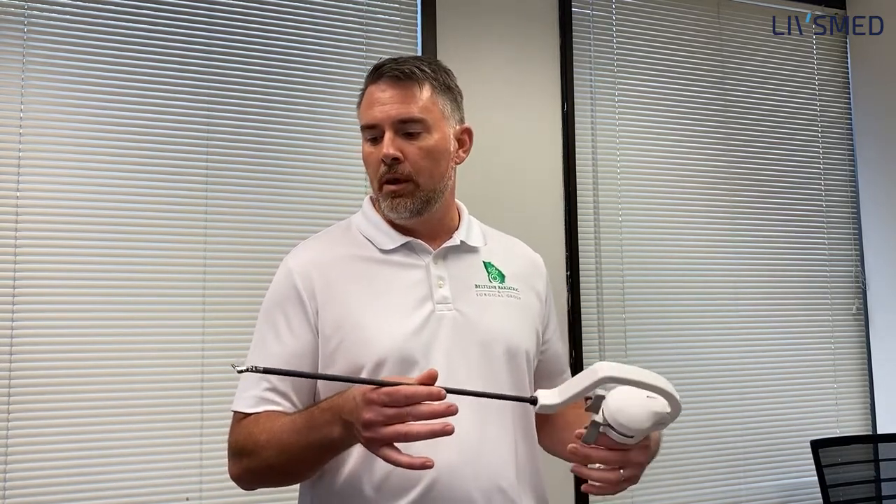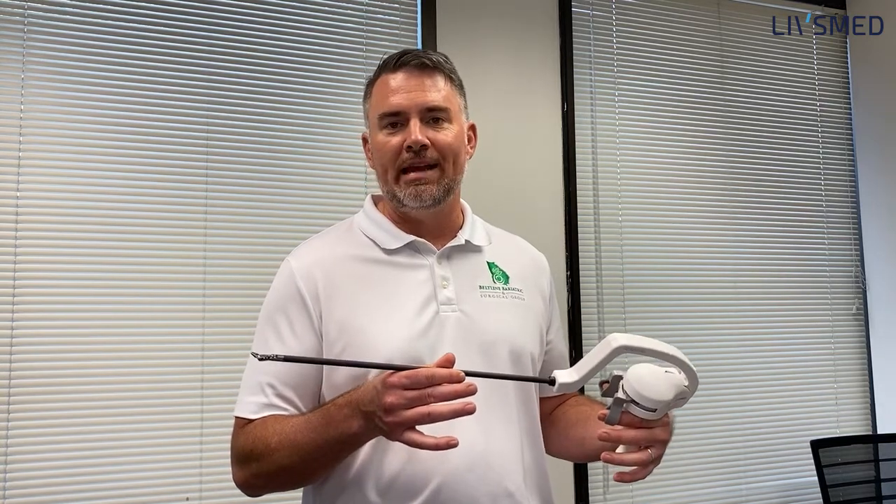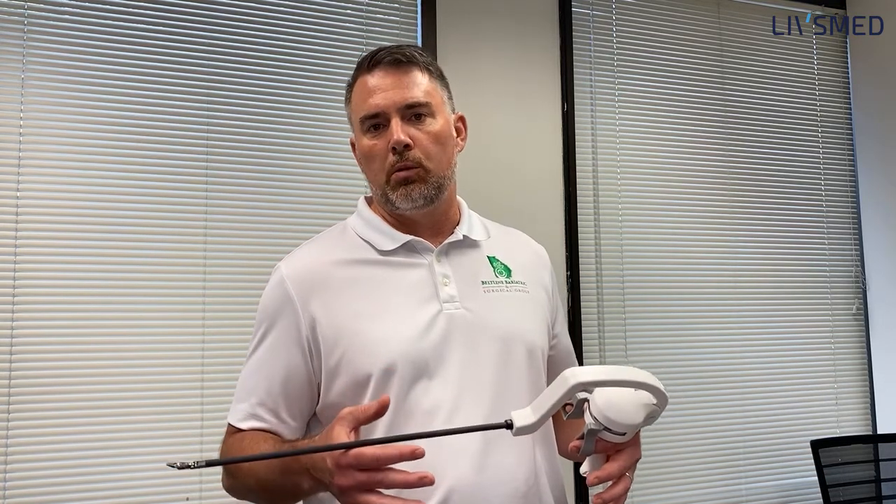These are needle drivers that have a wrist to them, very much like most surgical platforms that you'll be looking at. The reason why we begin using these instruments and why they're intriguing to all of us as surgeons is the ability to add that extra dimension to our intracorporeal sewing.